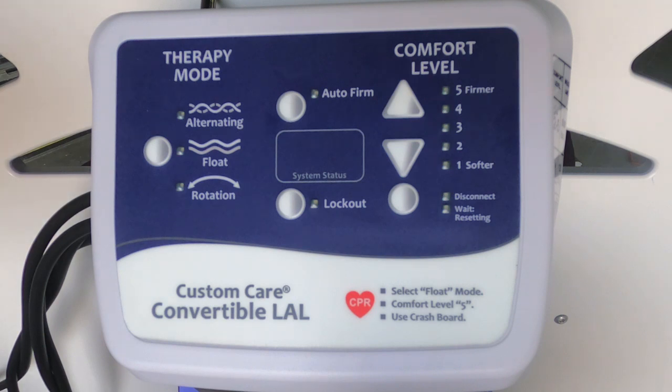There is a large tubing set that also plugs into this left side of the controller, and that is what provides the dedicated airflow to the mattress cover itself, which manages heat accumulation and moisture dissipation. So you want to make sure that that's connected and check that.